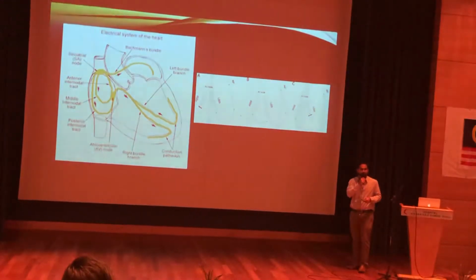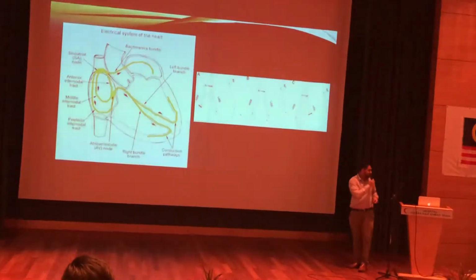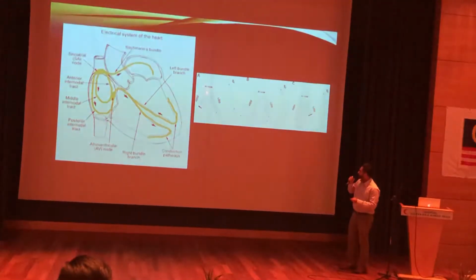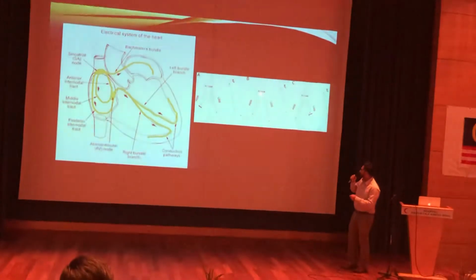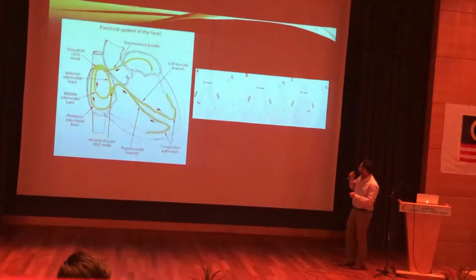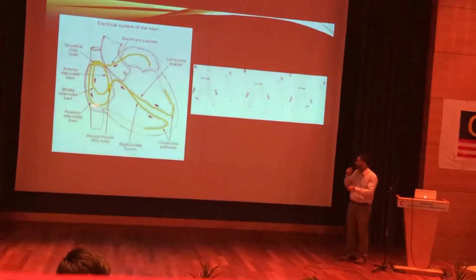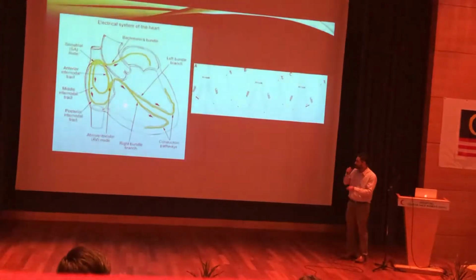So, what do you think the ECG is about? LBBB, yes, thank you, Dr. Shakir. So, have a look here. AV node, RBBB, LBBB. So, what happens is, conduction system usually goes from the left side of the heart to the right. Okay, this is how it goes, this direction.